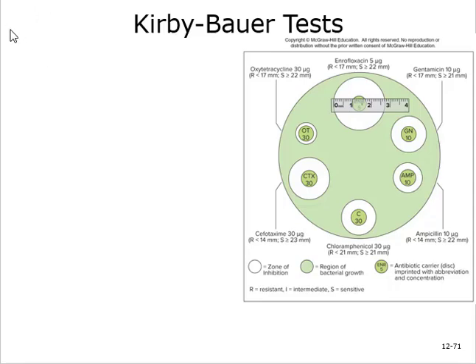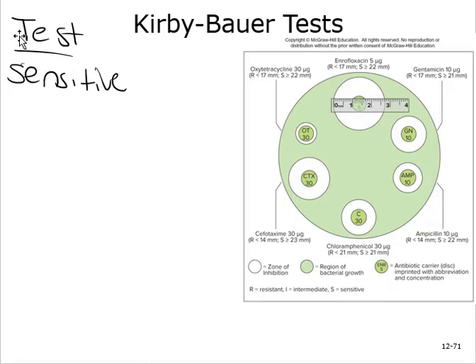The final thing to talk about with antibiotics is how do we test? How do we test to see if a bacteria is sensitive to the antibiotic, meaning the antibiotic will kill it, or if the bacteria is resistant to the antibiotic, meaning it can still grow in the presence of the drug.